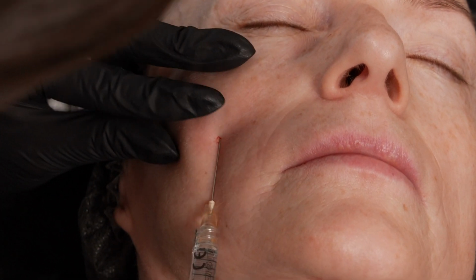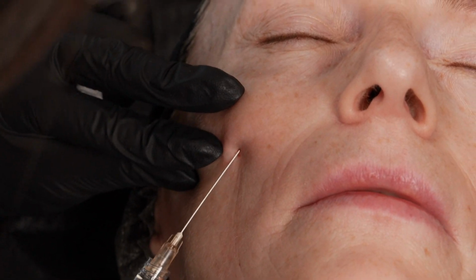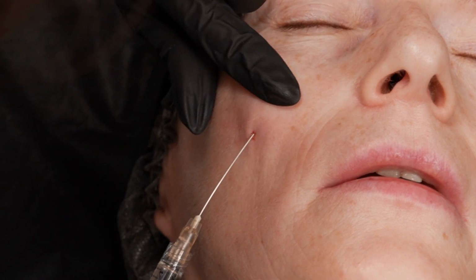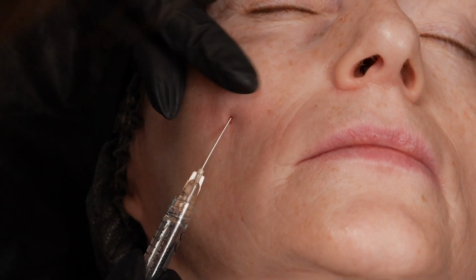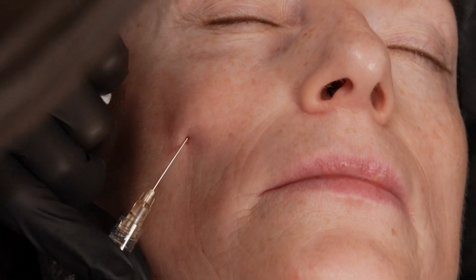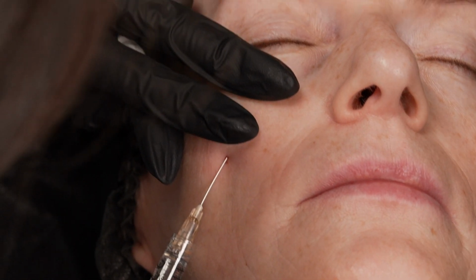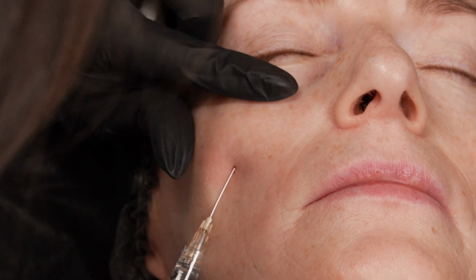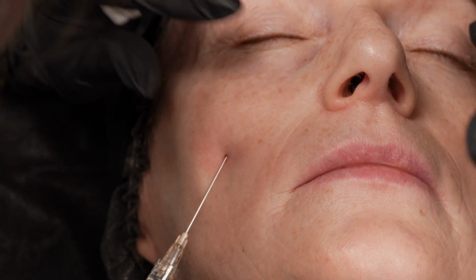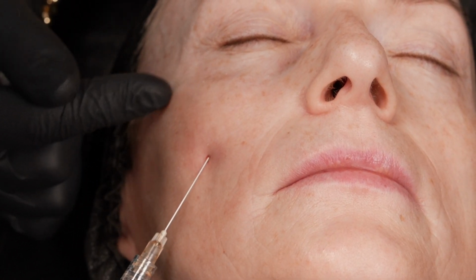You can, yes, but first support the deep tissues, then support the superficial fat, then check the sulcus. Last options. It's good. How much you gave? It's enough. 0.3 you gave it. So change your direction, come here and here.